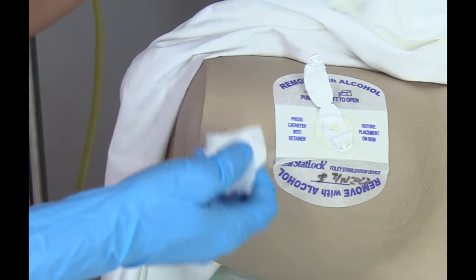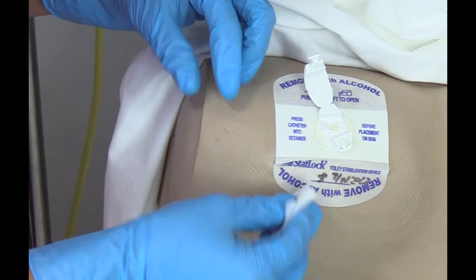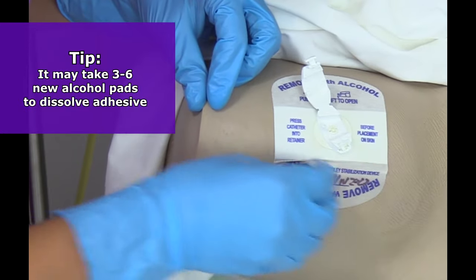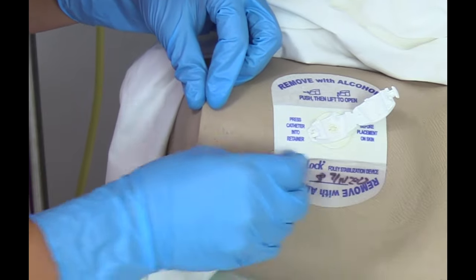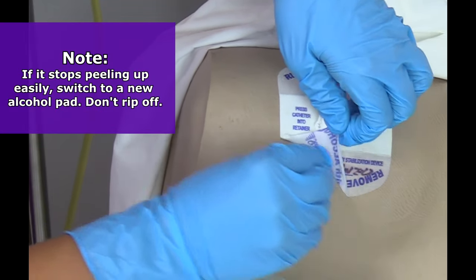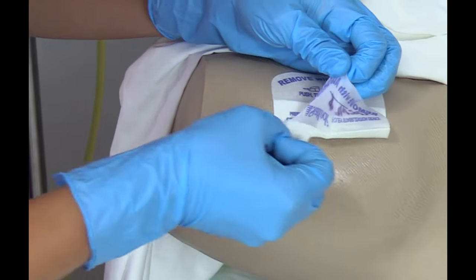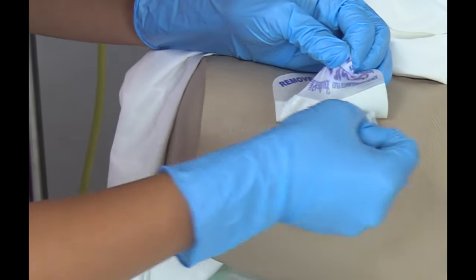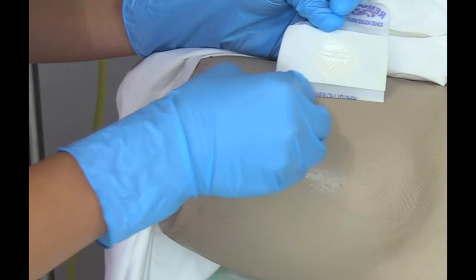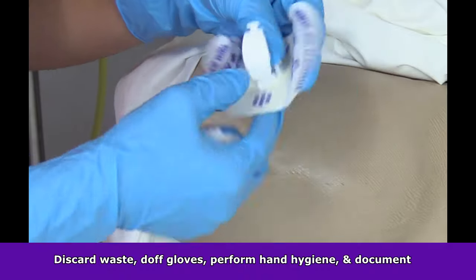We're going to take our alcohol prep — and it tells you right on the device: remove with alcohol. You can start on either side. Get the adhesive wet with alcohol; what this does is neutralize the adhesive on the patient's skin. It's already starting to come up — pull it up and keep cleaning the skin and the sticky part of the device and it just easily comes up. Do the same on the other side, pulling slightly while cleaning the patch and skin, and it just peels right off. This is so much more comfortable for your patient than just ripping it off, which could literally rip off that top layer of skin. Now we dispose of this.